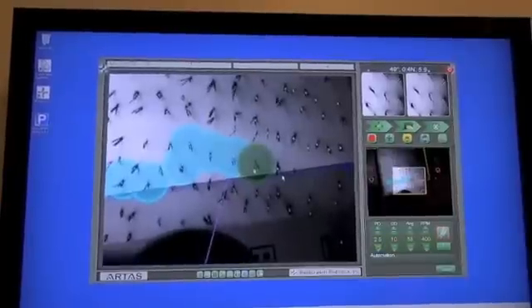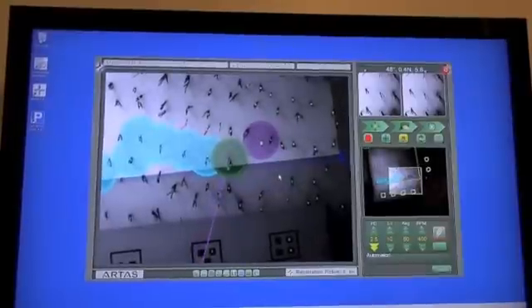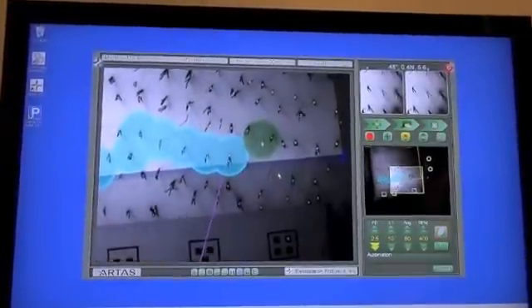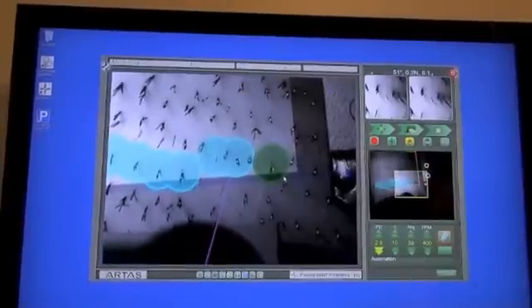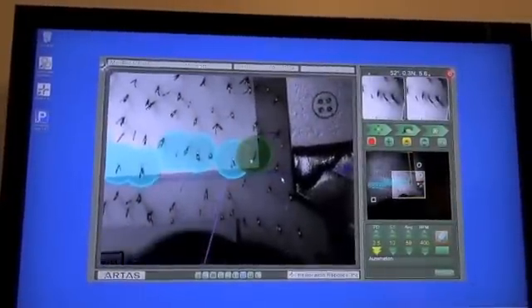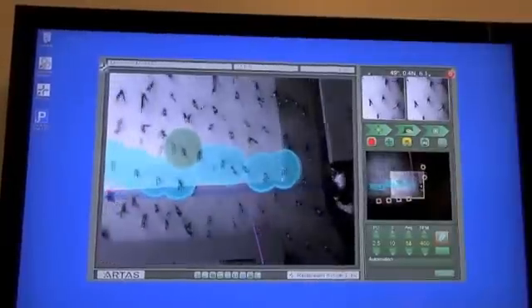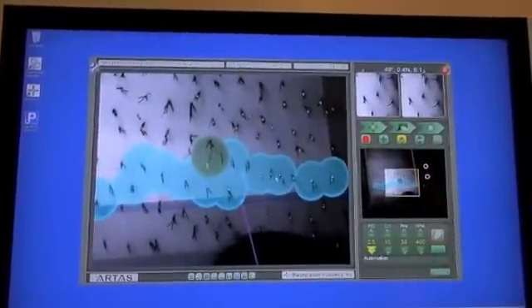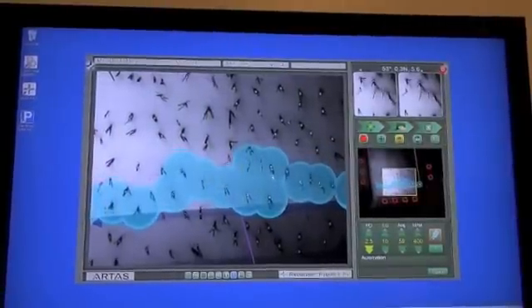The green and purple that we see gives us a choice that maybe we want to skip here. The physician operating the system has options. This is why there is a preview of the next one. This is a fully interactive system.